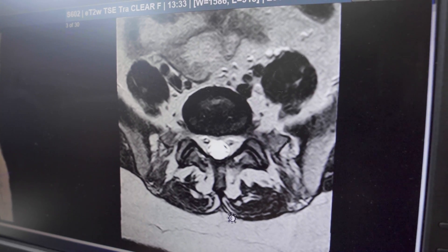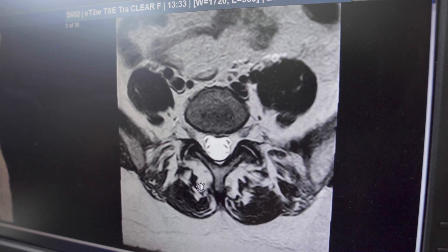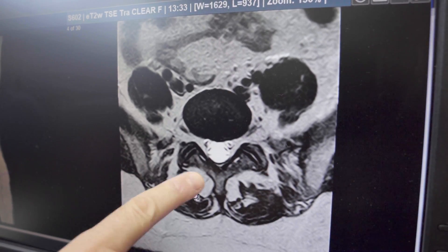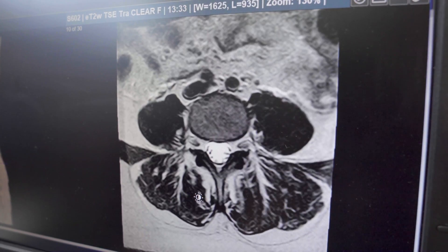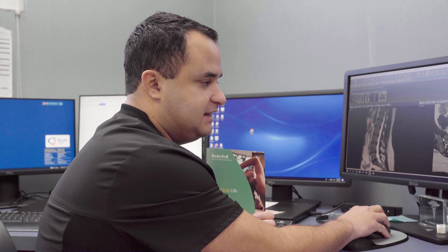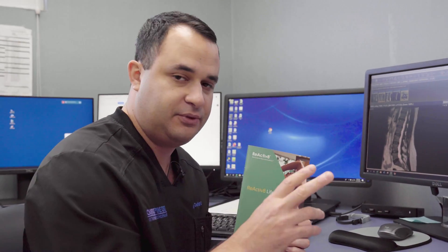We look at the MRI here and show that there's fatty infiltration — this white area going into the muscle — that causes that weakness. Up top at L1 and L2, these muscles look great: nice red muscles that show black on MRI, strong muscles. But as we come down into the lower lumbar, we see that white fat starting to infiltrate. That's what causes that deep ache.